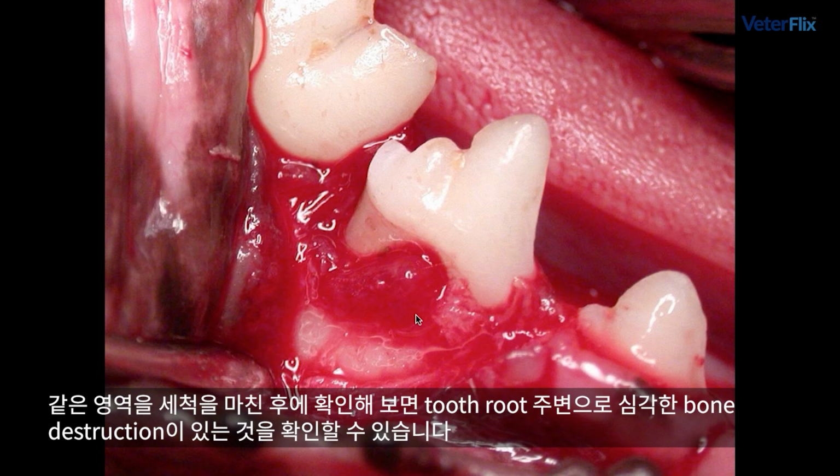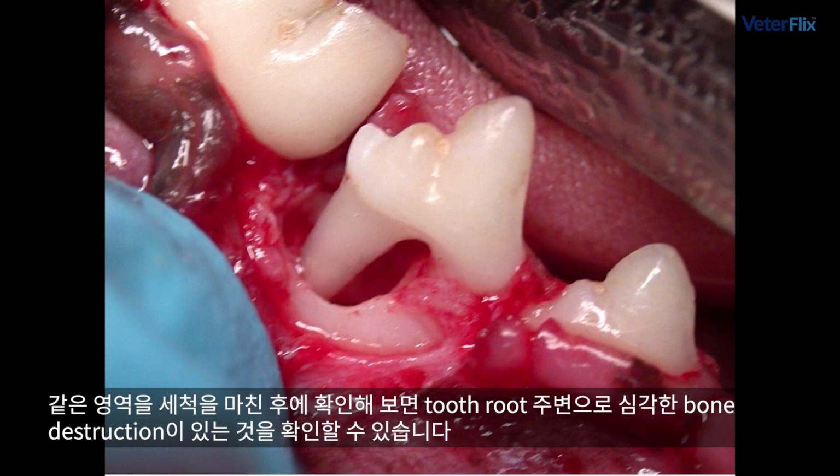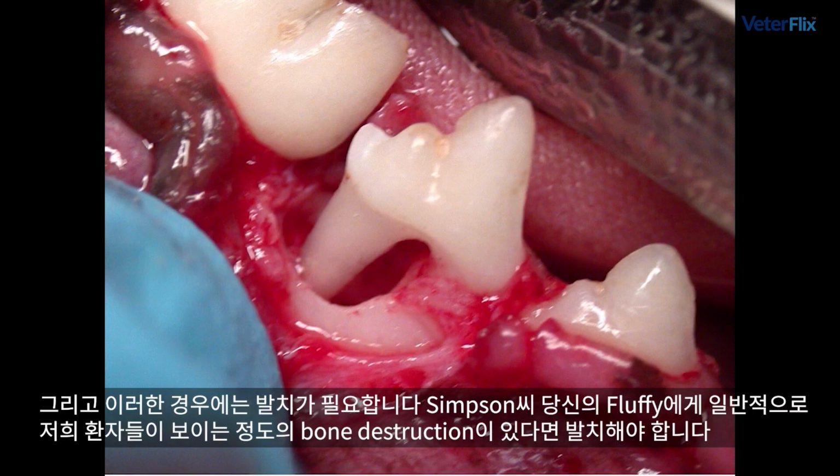If we look at the same area after we've cleaned that out, we can see that there's significant destruction of the bone around that tooth root. And obviously that's an extraction.